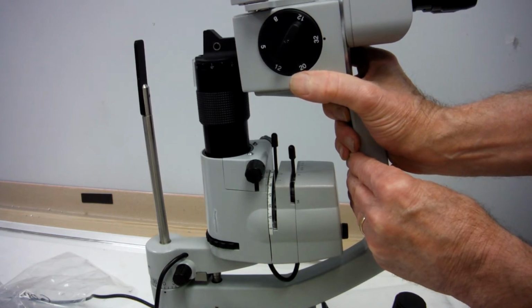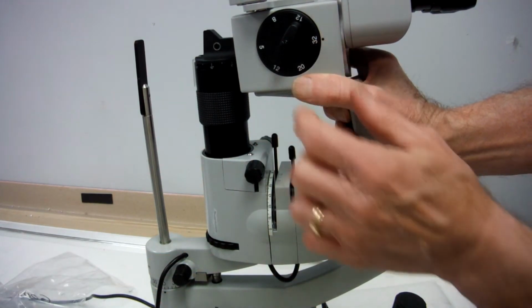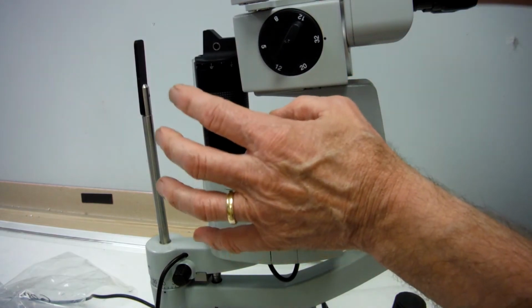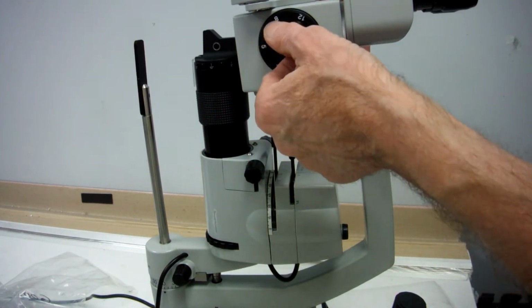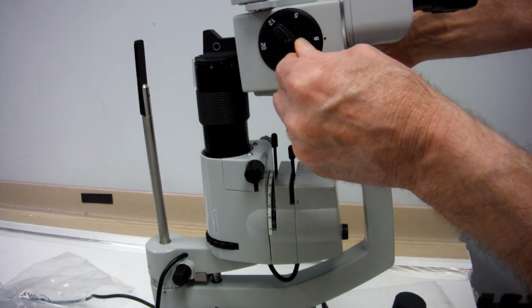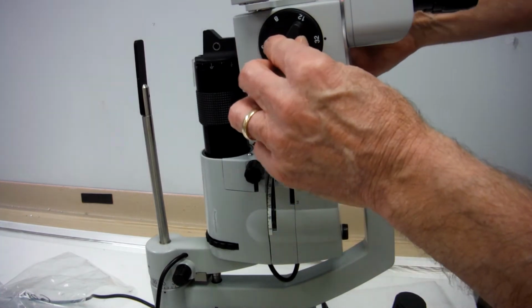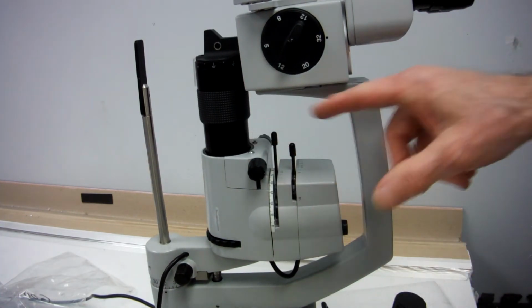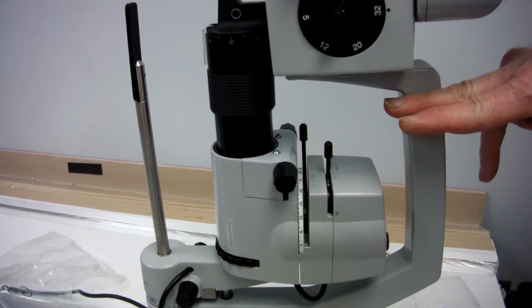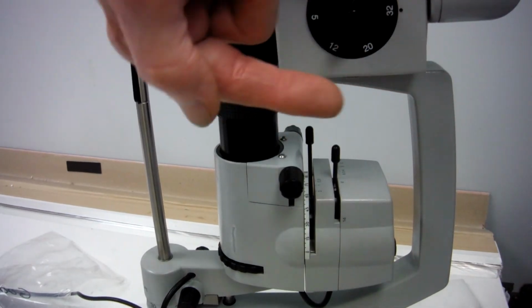And if nothing is bent, if your arms are not bent, if you can focus it on your highest mag, then once you tighten it down, it should be in focus on all the other mags. It should stay in focus. So if they don't, it's possible that your arms are bent. Something might have hit the microscope arm and bent it that way, or it could have been bent this way.